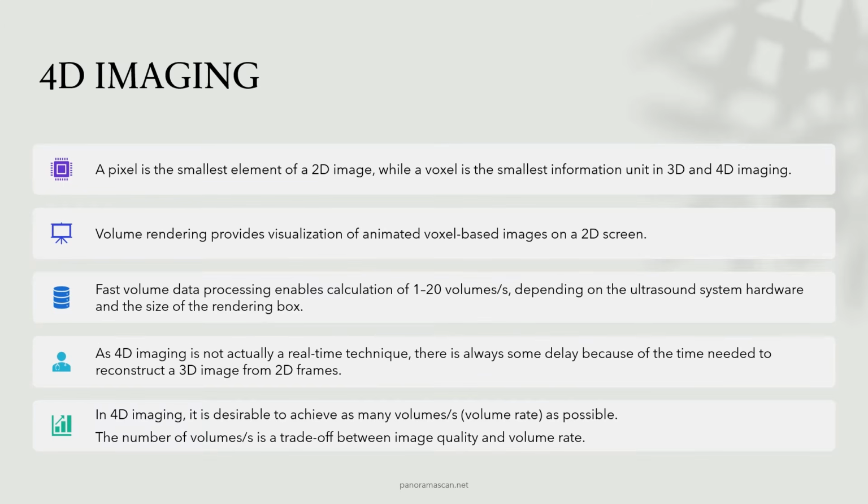While advancements in technology have minimized this delay, it's still a factor to consider, especially when trying to visualize dynamic movements or structures in motion. When it comes to 4D imaging, achieving the highest volume rate, the number of volumes per second, is desirable to ensure smooth and continuous imaging.